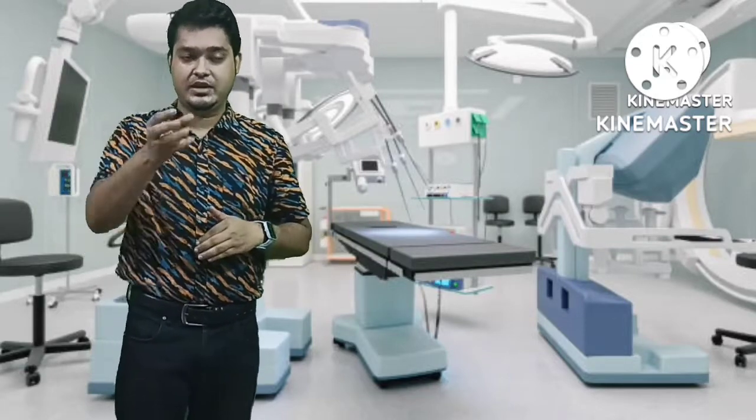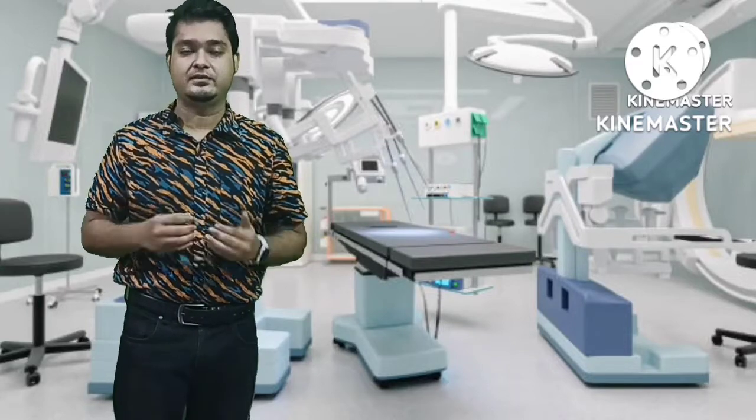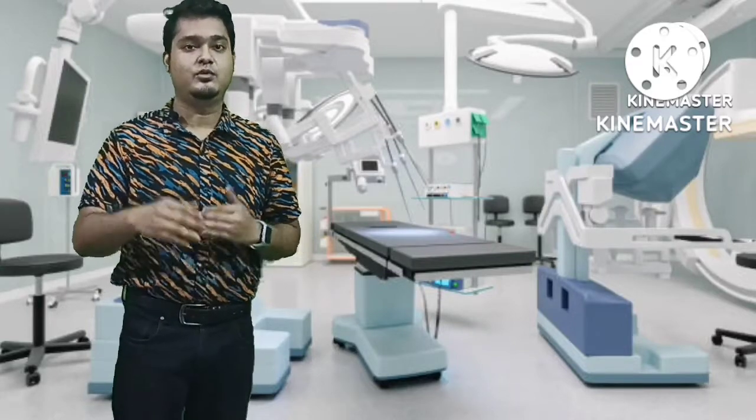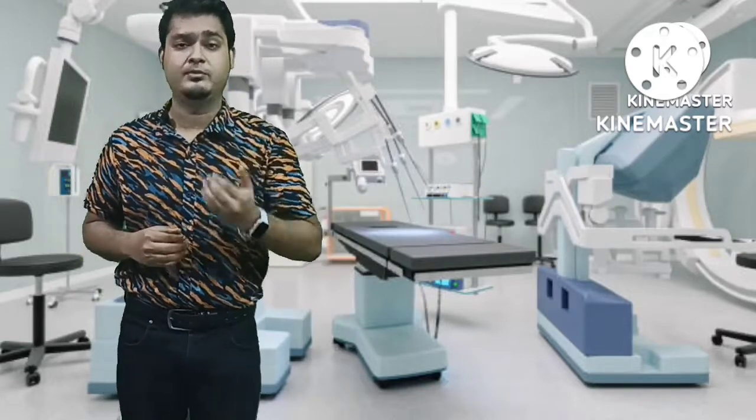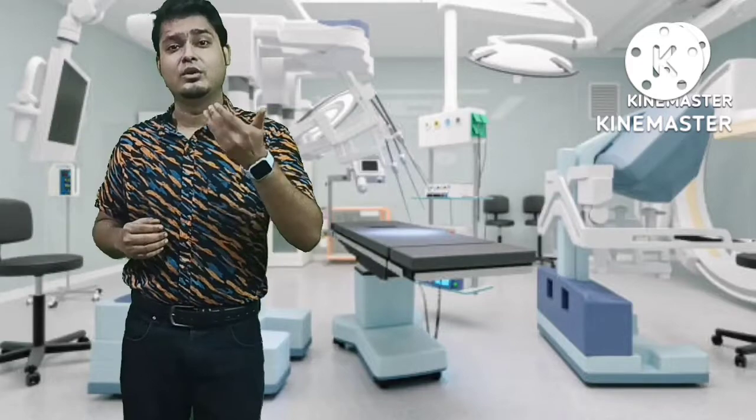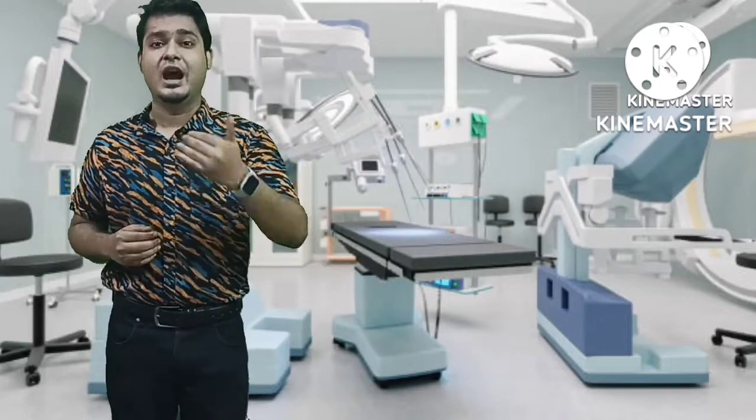So instruct the patient to take a soft breath and hold it like this. This is more comfortable for the patient, makes our examination more comfortable, and helps to acquire a good resolution image without any artifacts.